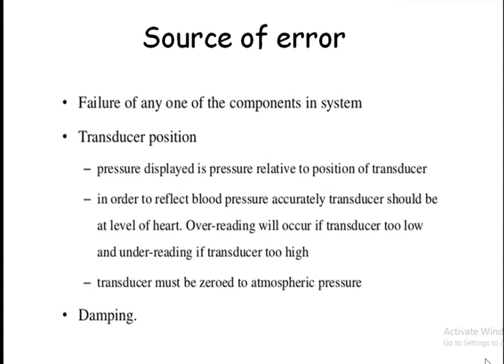If any component like the stopcock, pressure tubing, or the arterial cannula has a blockage, a kinking, or an occlusion, or if you haven't done the zeroing properly, or haven't kept the transducer or stopcock at the phlebostatic axis, all of these will lead to error in the reading. So these should always be taken into account when you are doing the recording. And another important term you can see here is damping. You should know what damping is.